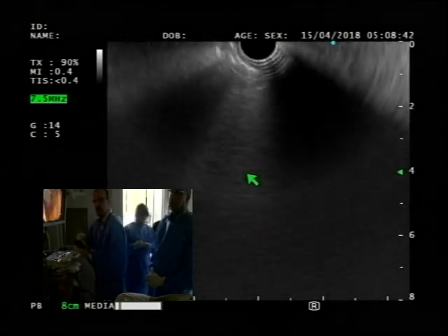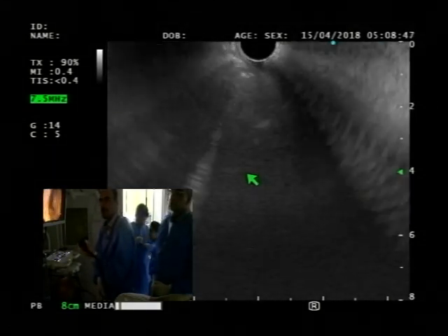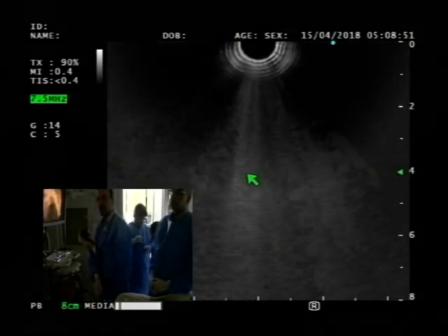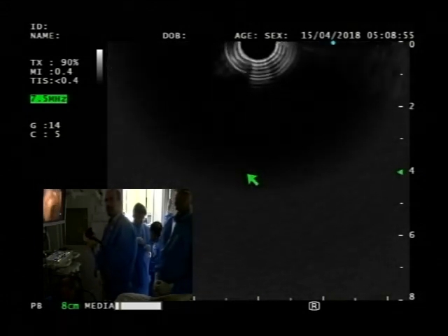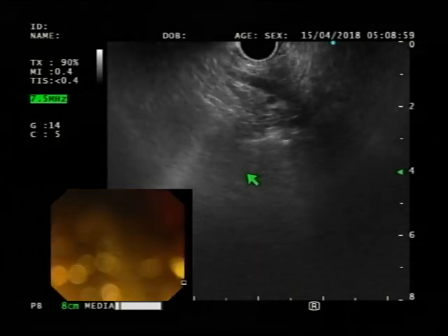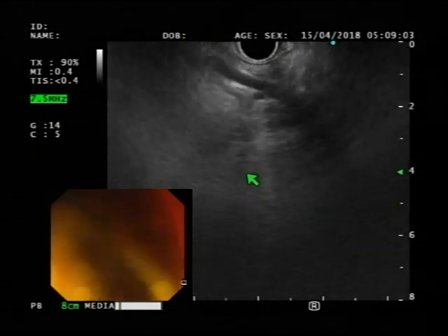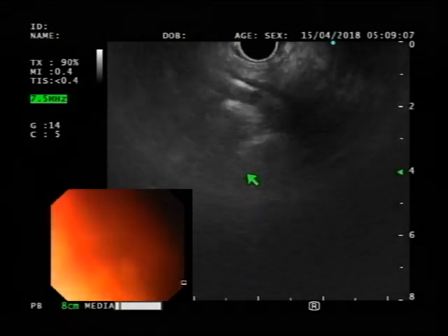So here, again, just like you did, the right wheel to the right. Let's see, where is our stent? So this is our stent. So I'm going to visualize where my stent is, typically advance just a bit, and thumb down. And right away we have mesenteric vessels. And then, because my probe is against the wall, I'm going to start gently pulling back.